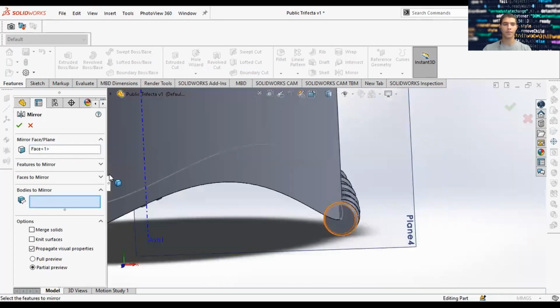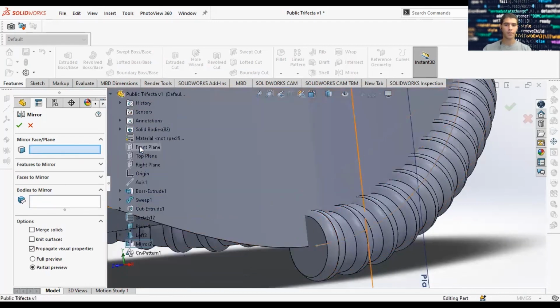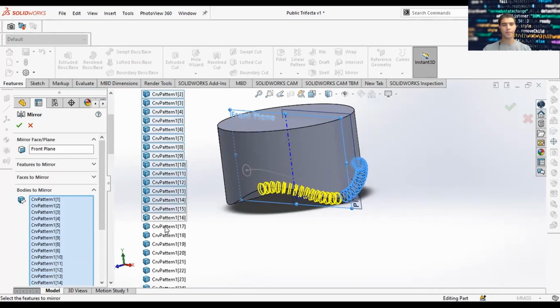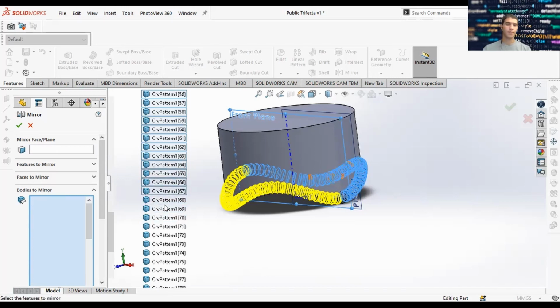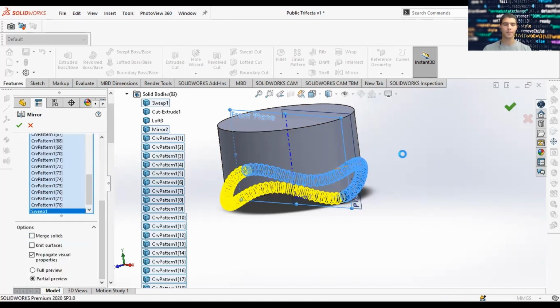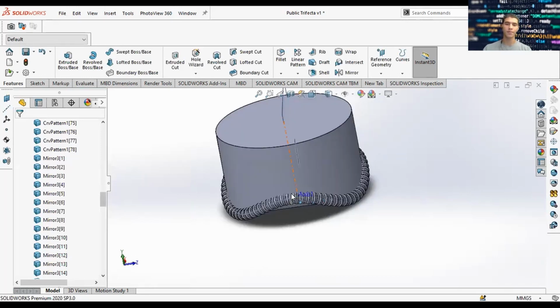So mirror, face. Select the bodies that we want to mirror. We have 82 bodies. 82 times the charm. So here we have our sweep. And then let's click OK. And so that will take us from 82 to 160 something. 164. And now we have the cuff throughout the entire cylinder. Looks nice.